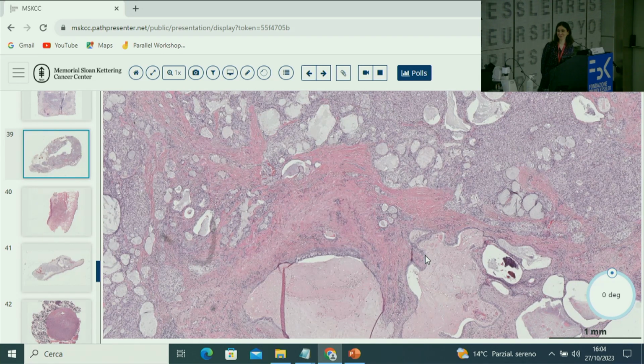Again, don't be a slave to the immuno or the molecular. We've seen cases with MAML2 rearrangement that look like mucoepidermoid but are negative, in cells that you expect to be squamoid, especially the intermediate cells, which are very plastic. Usually the immunostains follow the morphology. In the few cases we saw with negative or very focal P63 and P40, the cells usually showed foamy, spindle or oncocytic morphology, so not very typical. So if you put things together and do everything possible, we call these cases, I think we have 2 or 3, mucoepidermoid carcinoma despite the negative P63 and P40.